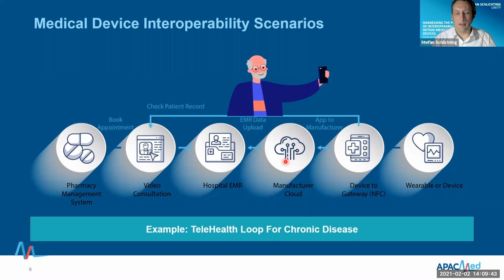This allows especially the clinical staff to look at all the up-to-date data, and the man that we follow here doesn't have to come into a hospital for that. What he's also offered during the telehealth consultation is that he can participate in a video consultation. And this will allow him, on a daily basis, for example, to talk to the nurse that helps him to manage his diabetes, and answer questions that may arise during the day.